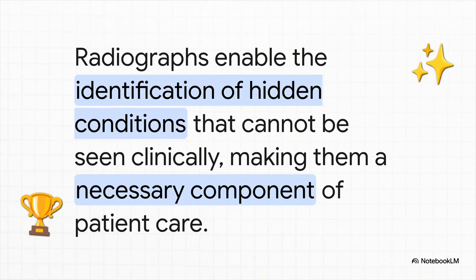From Roentgen's mysterious glowing screen all the way back in 1895 to the instant digital images we get today, the dental X-ray is still one of the most powerful tools we have in our arsenal. It's a simple, quick procedure that truly lets us see the invisible, and lets us stop small problems before they ever have a chance to become big ones.